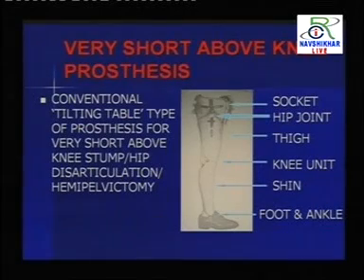उस केस में हम इसको एक छोटी स्टम्प अगर होती है उसको फ्लेक्स करके फ्लेक्शन पोजीशन में ले लेंगे और उस पोजीशन में लेके देन वी मेक अ सॉकेट एंड वी डू द प्रोस्थेटिक फिटिंग इन दैट केस. सो उसके अंदर जो हम प्रोस्थेसिस बनाते हैं दैट इज़ एक सॉकेट. हर प्रोस्थेटिक के अंदर बनेगा, बट द डिज़ाइन एंड द शेप ऑफ द सॉकेट विल बी एंटायरली डिफरेंट फ्रॉम ईच अदर. जैसा जैसा स्टम्प होगा वैसा वैसा उसका सॉकेट बनाया जाता है.